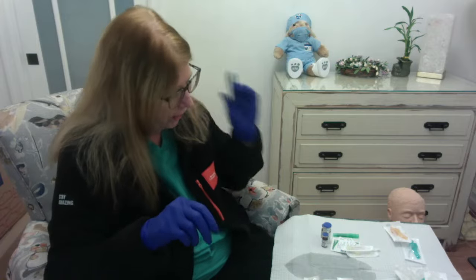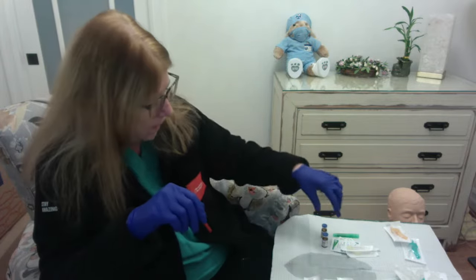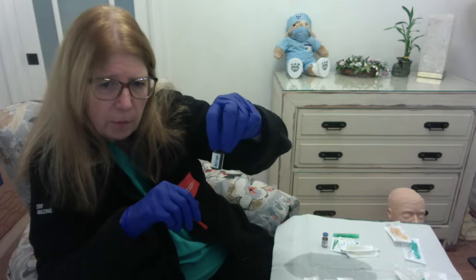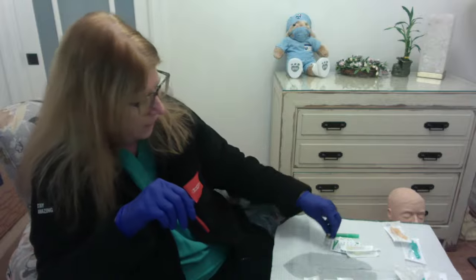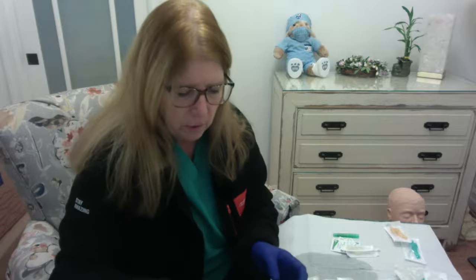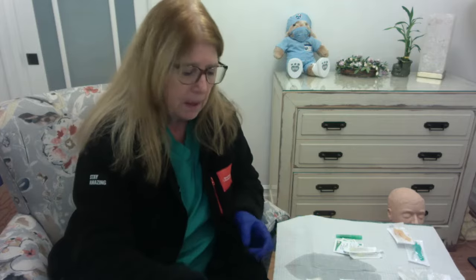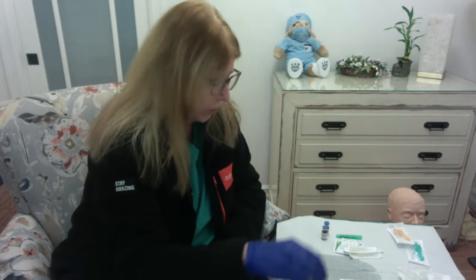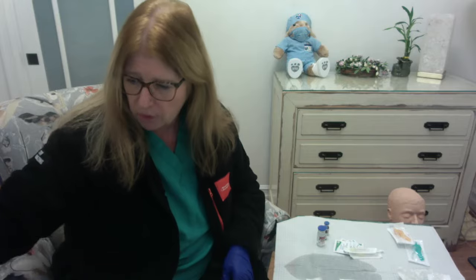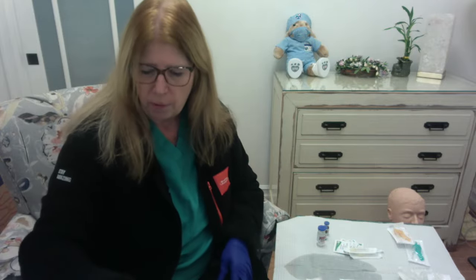Now, we also have vials. We have different size vials. This is a vial of insulin, okay? And this is a vial of Benadryl, and you'll notice it's in a dark glass because it needs to be protected from light. This is a vial of folic acid, okay? So these vials are sometimes single-use or they are multi-use, meaning that you can get multiple doses out of the vial.